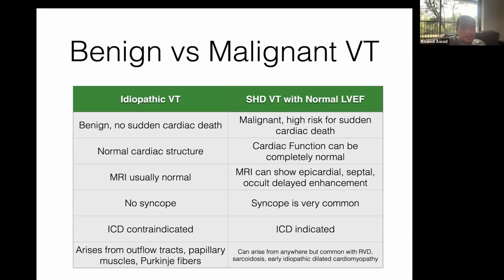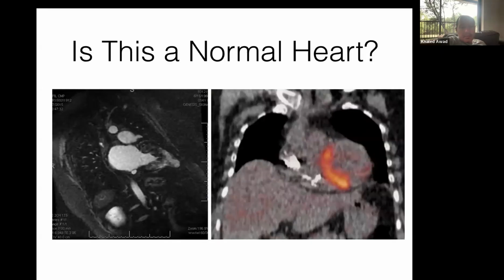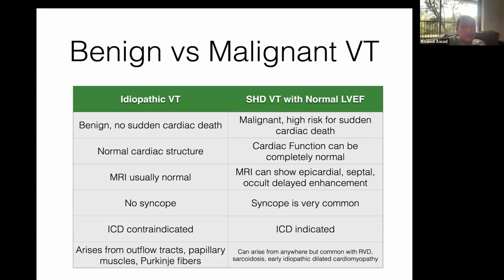Really hard is sometimes to put it into bullet points. It takes a little bit of experience and having been there, looking at the signals, where you're looking, if there are signals fractionated, you have late potentials, can sometimes happen in idiopathic VT. But if you have extensive late potentials, you have multiple QRS morphologies, multiple VT morphologies, all of that is more suggestive of structural heart disease VT.